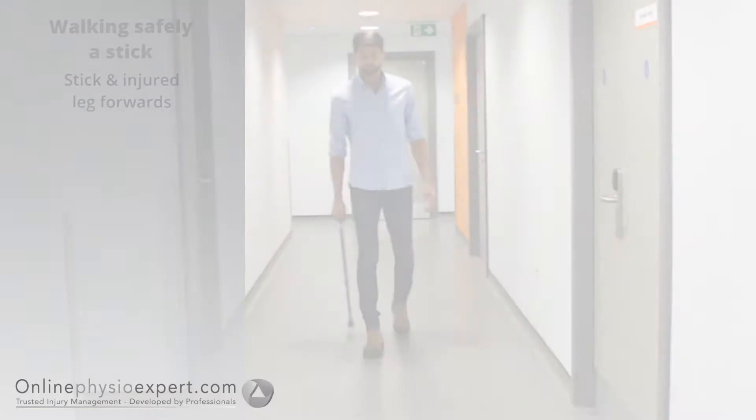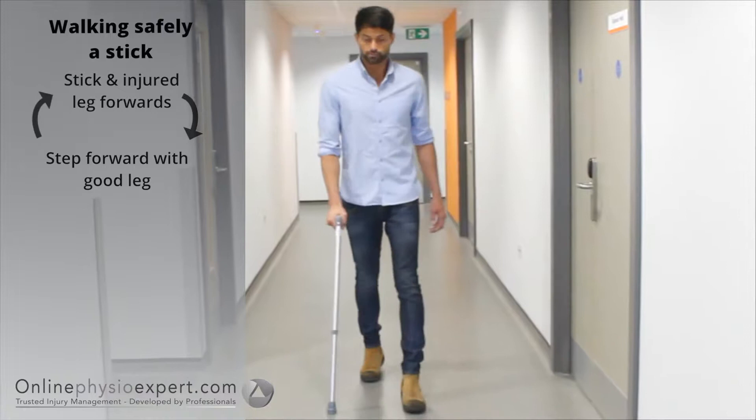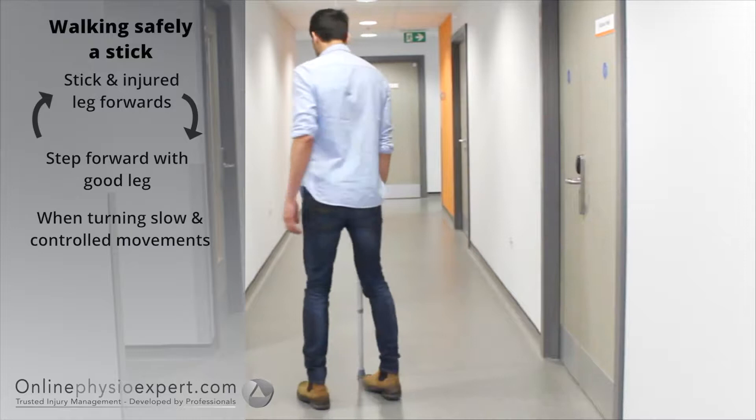To walk safely with a stick, place the stick a short distance in front with your injured leg. Step a comfortable distance through with your good leg. When turning or manoeuvring in tight spaces, ensure you step round in a controlled manner to change direction. As pain and balance allow, increase your stride length.